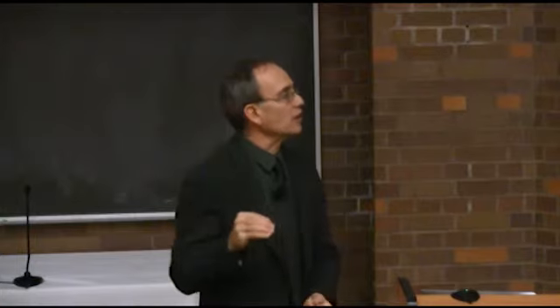Yeah, so sorry, that's the T2 signal, but certainly that's very clear evidence in the acute situation that there seems to be more acute myocardial edema in the patients with diabetes. Is there overall edema upon exertion? That's not a study we've done yet, but it's certainly a question we're looking into, and we were starting to see some evidence.